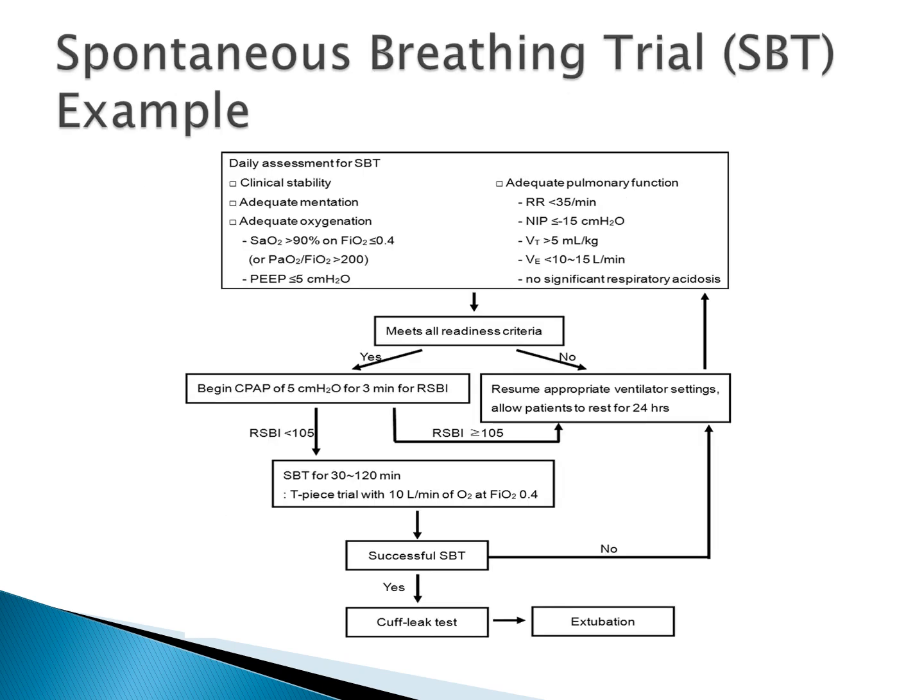So this is an example of a simplified algorithm for a spontaneous breathing trial. If you look at the top portion, the large rectangular box shown here, the process starts with assessing your patient's weanability. Some of the specific examples are mentioned. They're talking about overall clinical stability. Again, some of this may be self-evident, maybe it is, maybe it isn't, but we're talking about clinical stability.